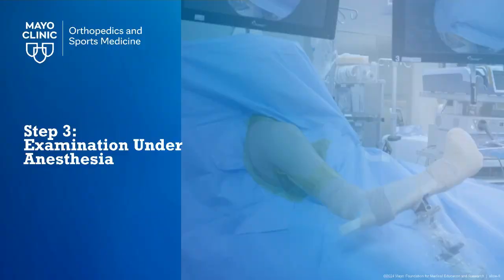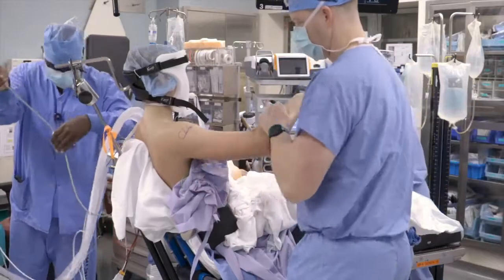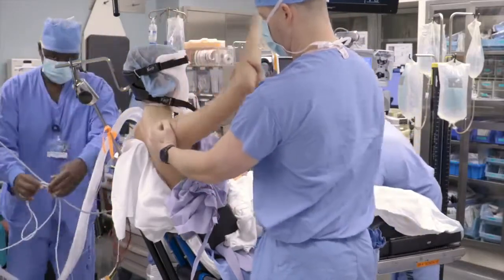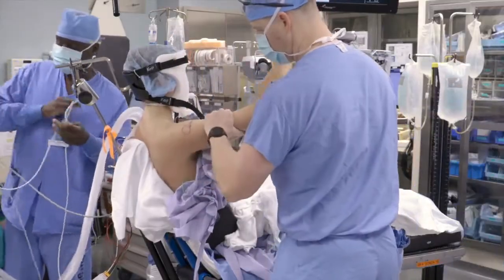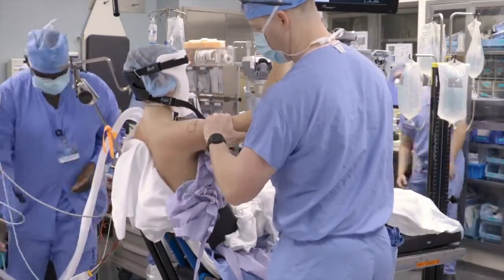At this point in time, a full examination under anesthesia should be performed. This typically includes full range of motion in all planes including abduction, forward elevation, and external rotation. Glenohumeral stability is also examined including anterior, posterior load and shift, and a sulcus sign.